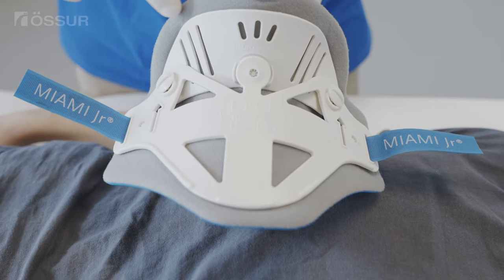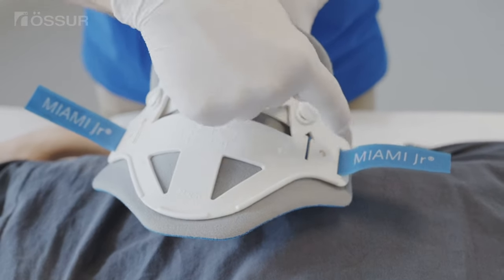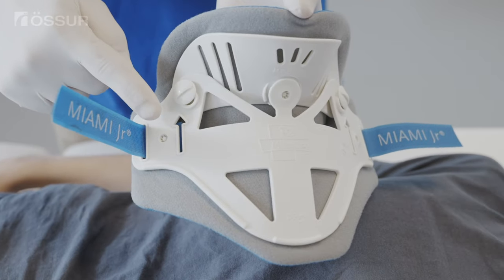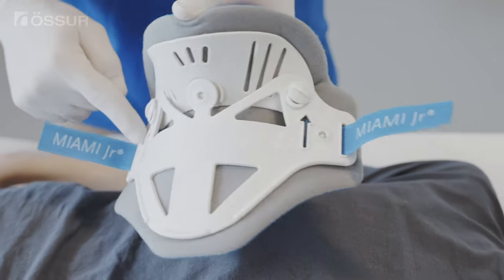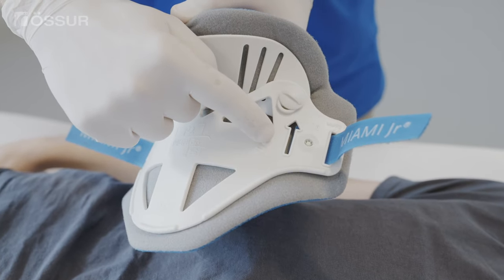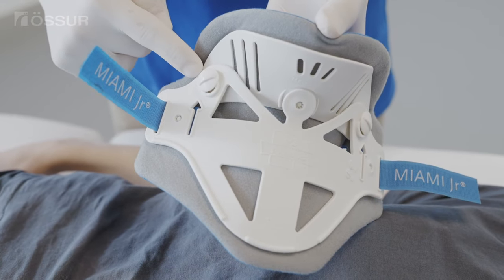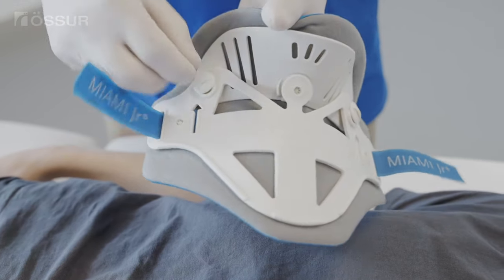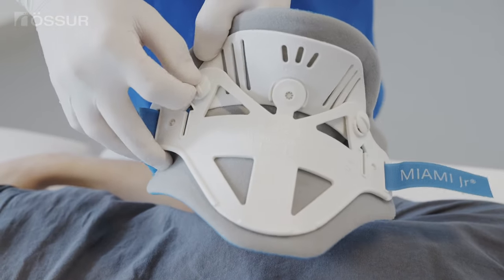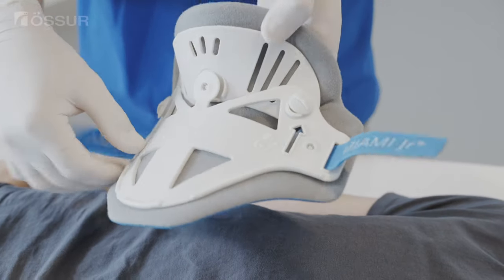Ensure the Sorbitex padding extends beyond the edge of the plastic. Note the arrows on the panel pointing up. Angulation buttons on the posterior shell are always shipped in the upright and locked position — this will be the best anatomical fit for most patients. At the discretion of the clinical team, unlock and adjust while it is off the patient following skin checks.